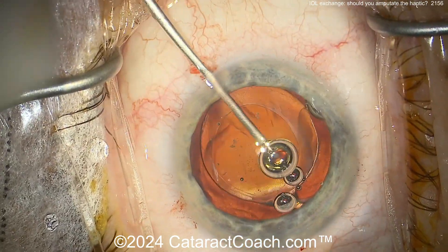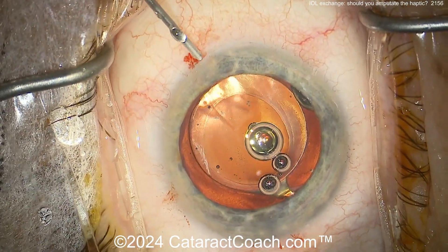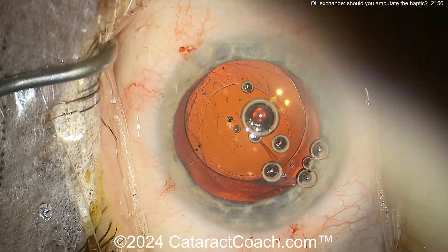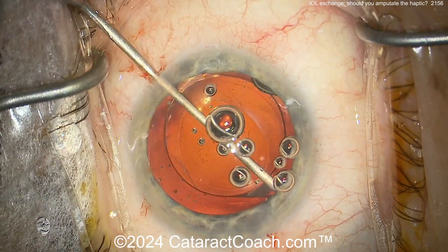Now you can look at this lens — it's an Alcon design, looks like the AcrySof or maybe Clarion material, and we know these lenses have a bulbous tip at the end of the haptic. Doing the visco dissection here is important, but you really have to open up the capsule bag. What happens is the anterior and posterior leaflets of the capsule bag get fused together.